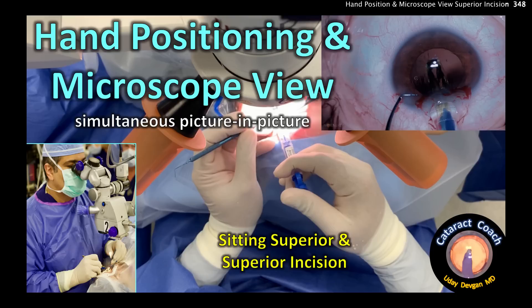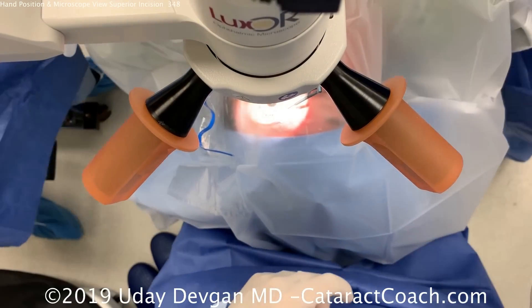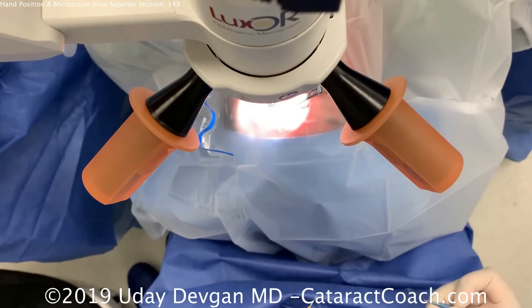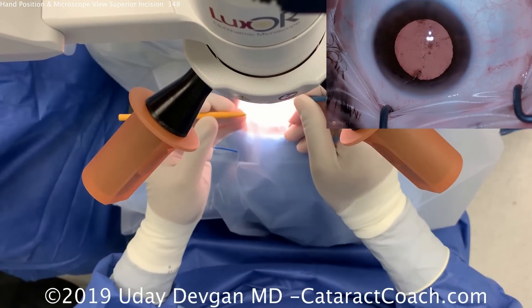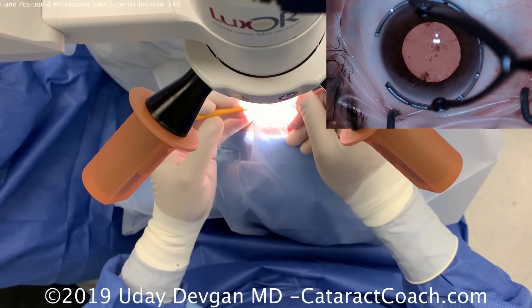From cataractcoach.com, this video demonstrates hand positioning with a simultaneous microscope view using picture-in-picture, with the surgeon sitting superiorly. This is a patient who has with-the-rule astigmatism, so we're going to make our incision at the superior 12 o'clock position.